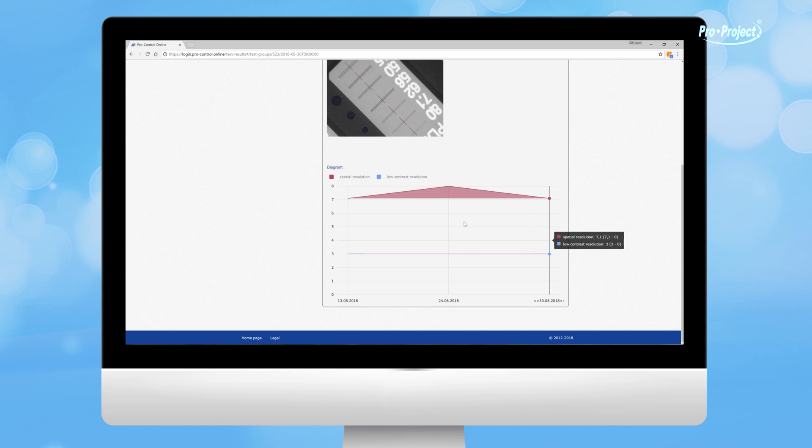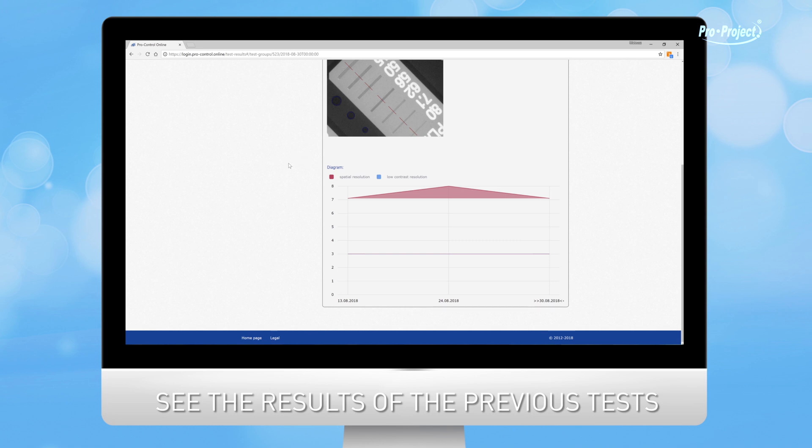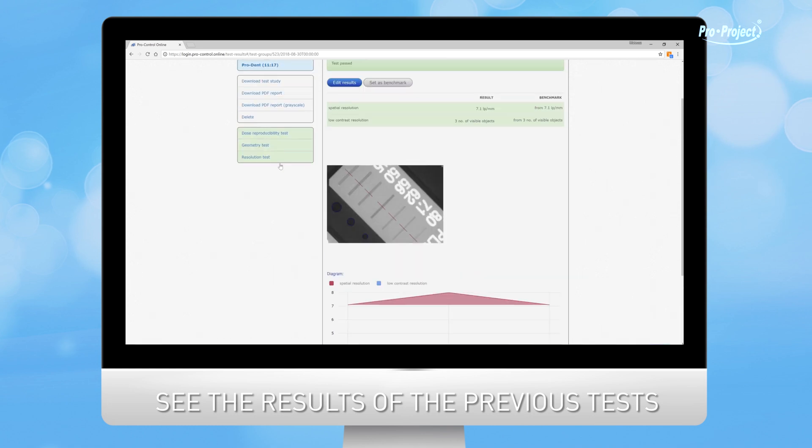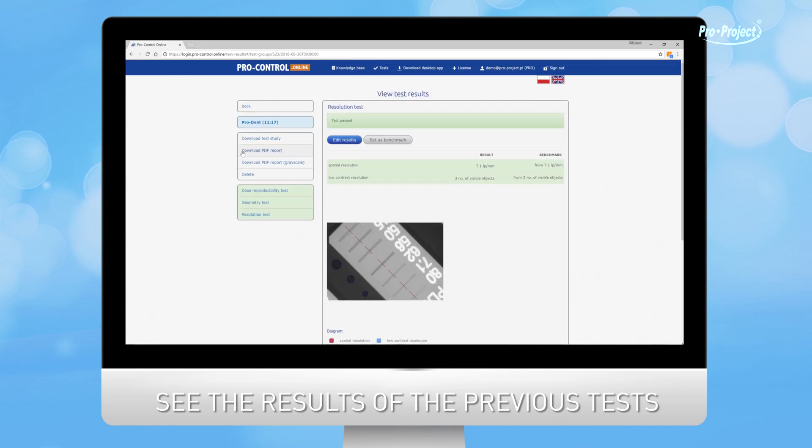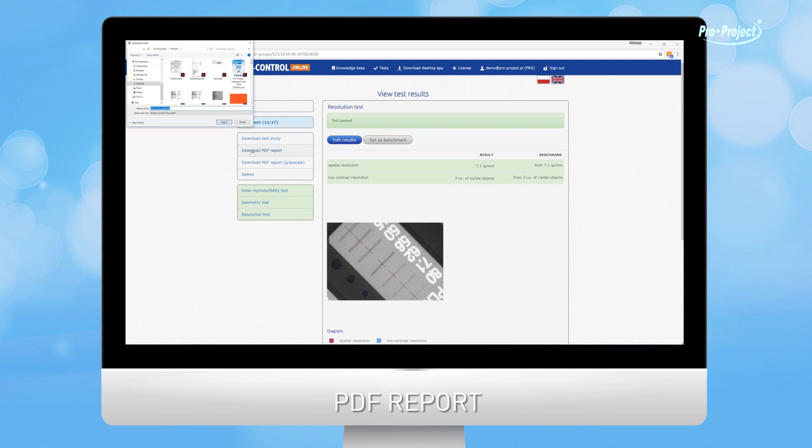In addition to the results of the currently viewed test, you can also see the results of the previous tests on the trend diagrams. You can also find here a detailed PDF report for this day's tests.